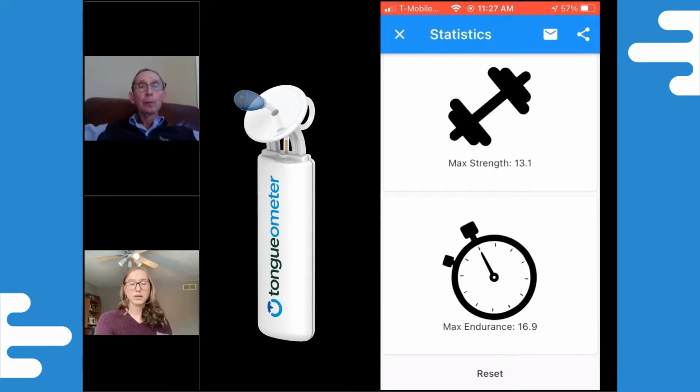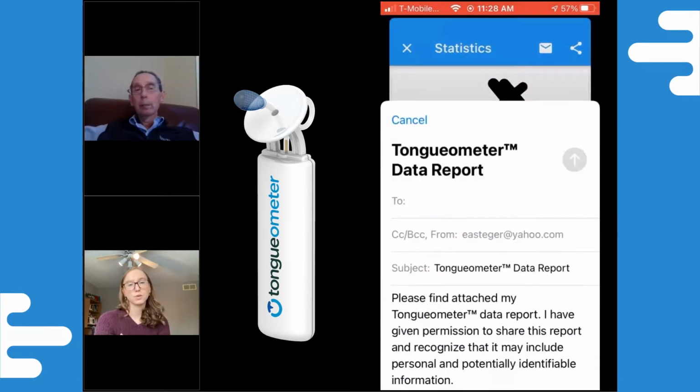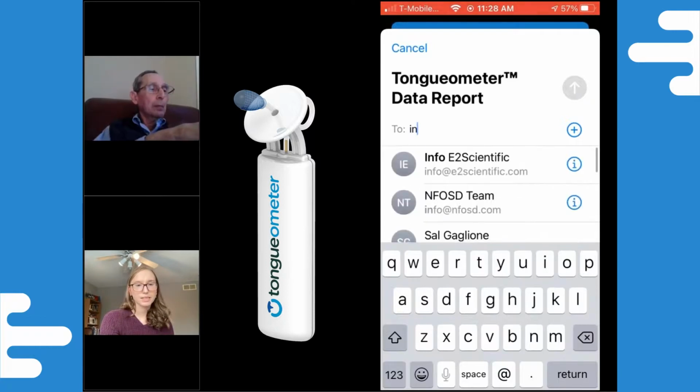If Ed wanted to share his exercise report with me remotely, he can do that directly from his phone. And there's two options. You can click that email button, and again, that shows a pop-up here that says that you're sharing your data report. The information that's included inside the report is the date of your practice, and then each repetition that you performed and how much pressure you applied, the length of time you held it for. And once you click the email, it will pop up here. And you type in the email address to whomever you wish to send it to. And there's a pre-drafted template for what the email says.